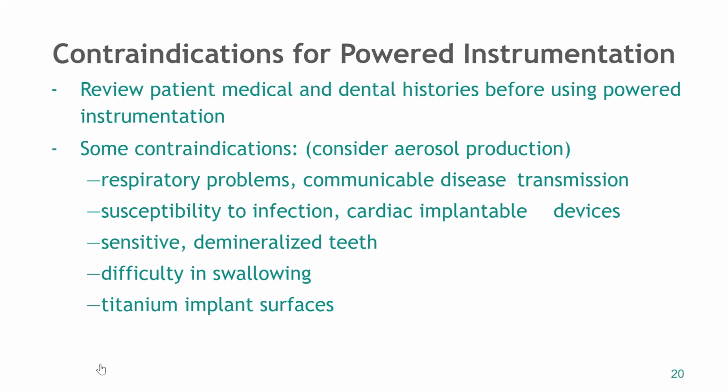We don't want to use this on sensitive or demineralized teeth, because the Cavitron can actually break through the demineralization. So if someone has generalized demin, we're not going to use the Cavitron. If they're really, really sensitive, they have a lot of root exposure, and they tell you from the very beginning that they're sensitive, I would limit the amount of Cavitron usage. Now, if they have a pocket or an area that's bleeding a lot when I'm scaling, I might use it a little bit localized, but I probably wouldn't use it all over.